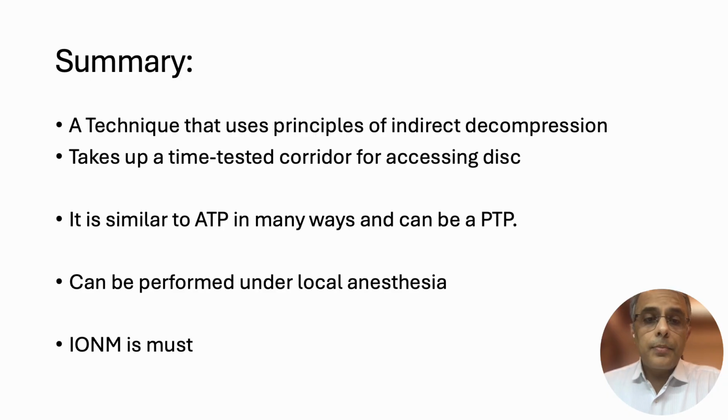To summarize, it is a technique that uses the principles of indirect decompression and takes up a time-tested corridor for accessing the disc. It is similar to ATP in many ways, and we term it the posterior to psoas approach. It can be performed under local anesthesia, but I always perform it under general anesthesia. Intraoperative neuromonitoring is a must.